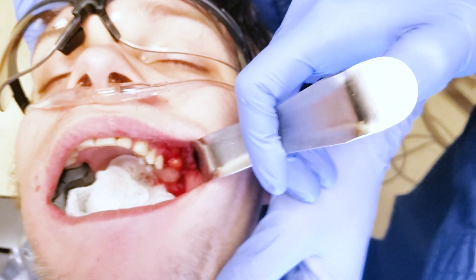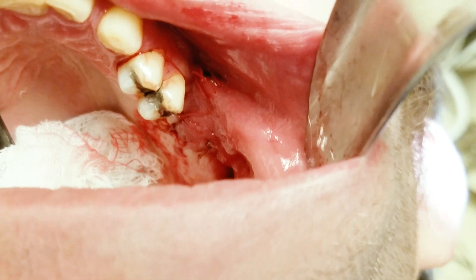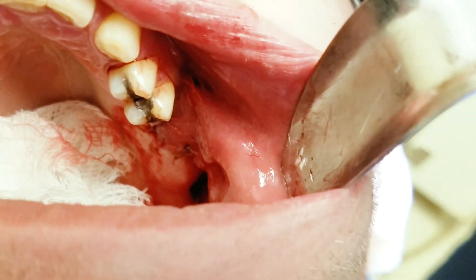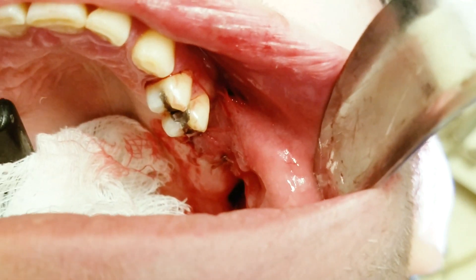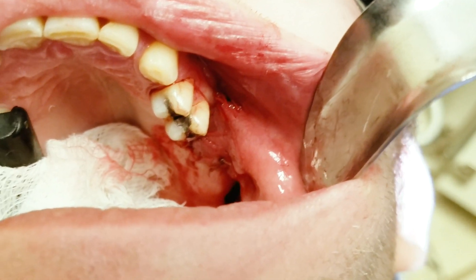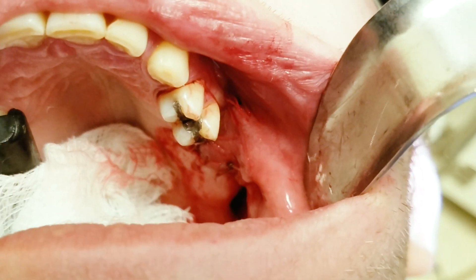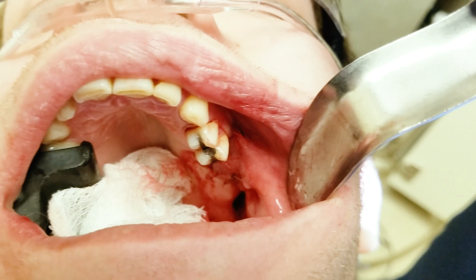Hope you guys can appreciate that. If you have any questions let me know. You can see it is all closed out in three layers — looks very nice. Now we just need compliance on smoking cessation and sinus precautions and we'll be good to go. Thank you.